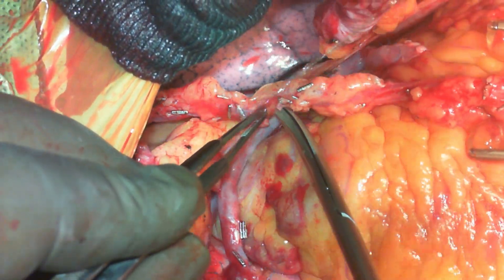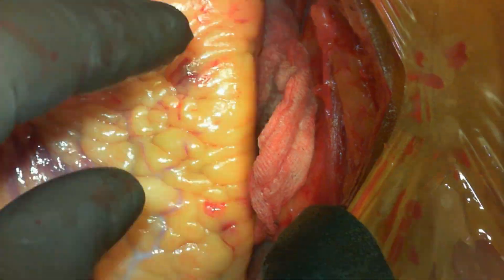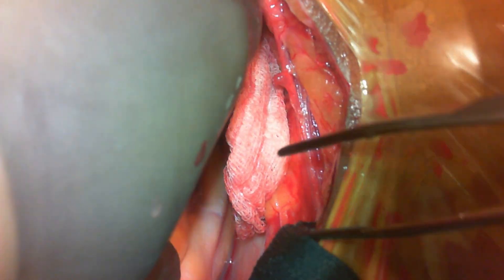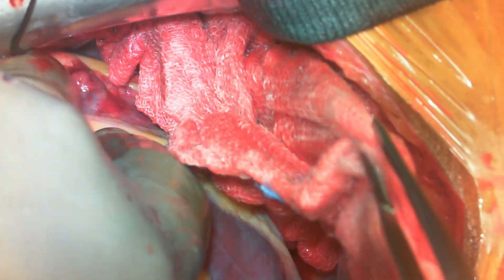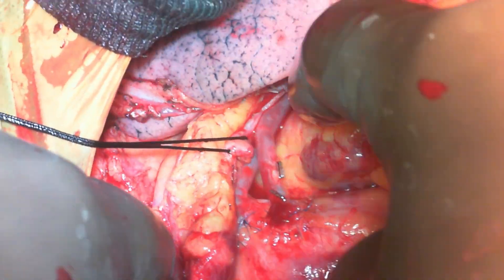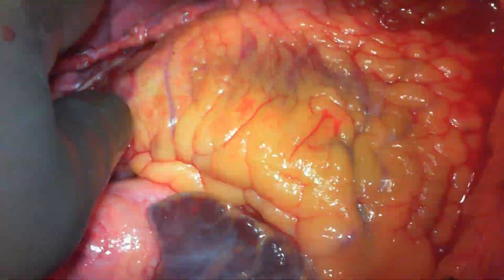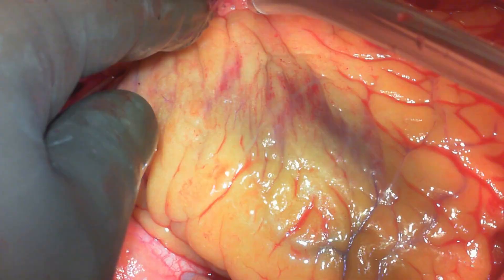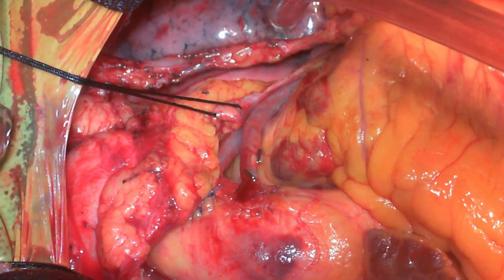The heart is lifted with the pack, and once I take this pack off, the actual situation is revealed. With the lung down and the heart returned to its normal anatomical position, you can see the lung is still trying to push the mammary, thereby stretching it. I will again fix this lung.